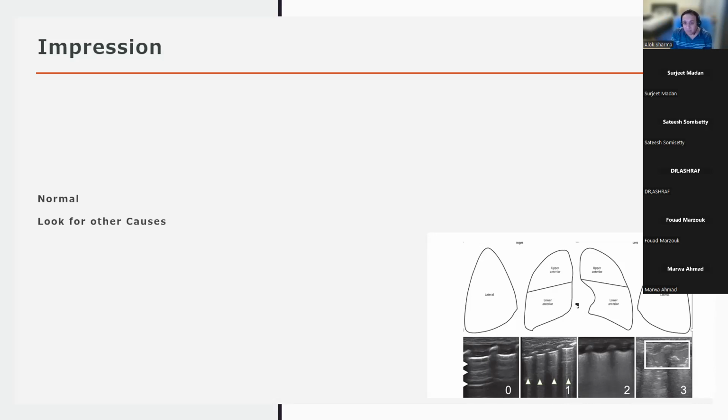I don't, in my clinical practice, feel that they give a significant amount of benefit in determining the first dose of surfactant. But where comprehensive scanning is important is if your baby is not improving and you really want to look for lung atelectasis at the back, for recruitment. I have colleagues who disagree with that approach, and it'll be very interesting to speak to Nadia. Nadia will be presenting a little bit more. She's an expert, so when you have the expert speaker sessions, we can ask her the question as well.